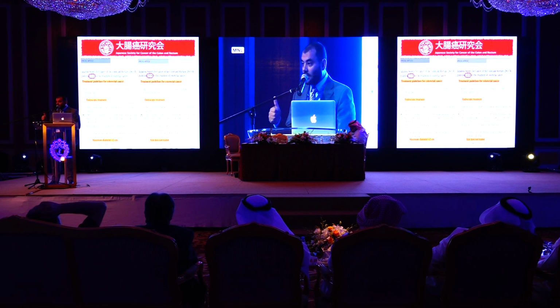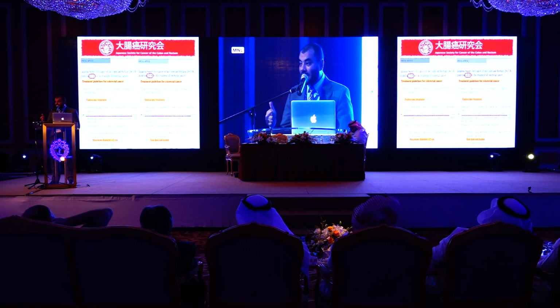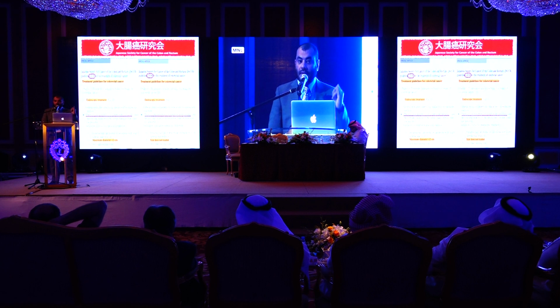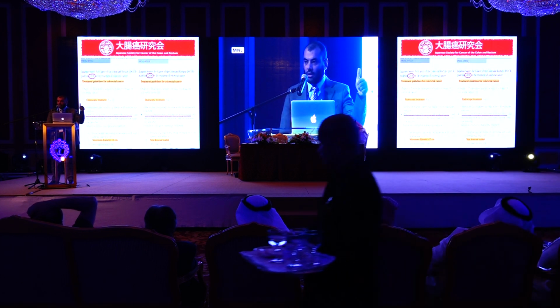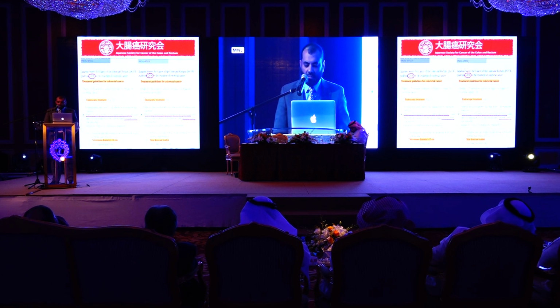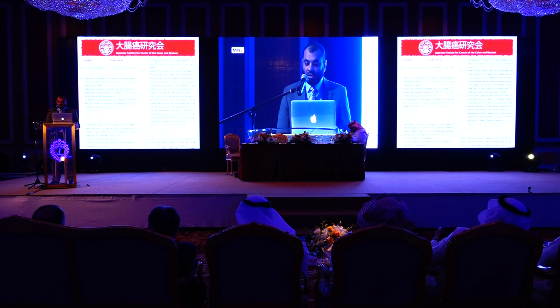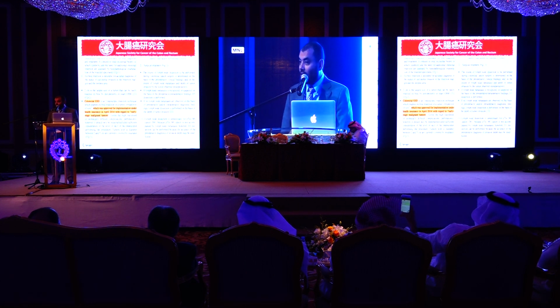According to the Japanese Society guidelines 2010, 2014, and 2016, any lesion can be resected endoscopically if there is little possibility of lymph node metastasis and you can remove it as one piece en bloc, so either EMR or ESD. So any polyp, whatever its size, shape, histology, or location, if you can remove it as one piece en bloc, remove it, provided that there is no lymph node metastasis. In the 2010 guidelines, the maximum diameter you can remove is 2 centimeters. But in 2014 and 2016, the size doesn't matter. Why? Because they approved ESD for treatment of those lesions and to be implemented under health insurance.